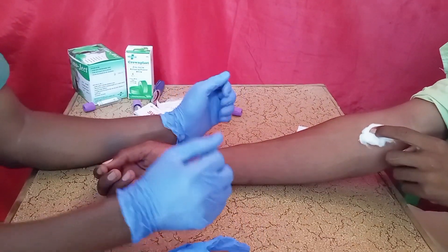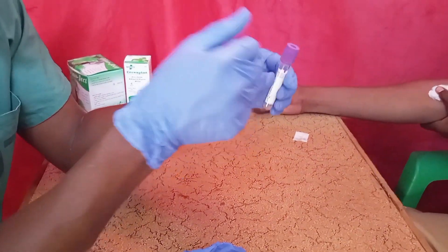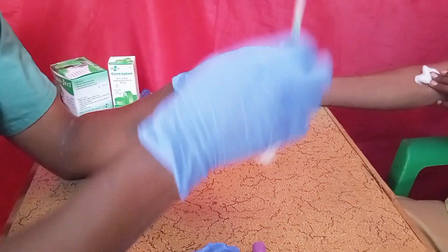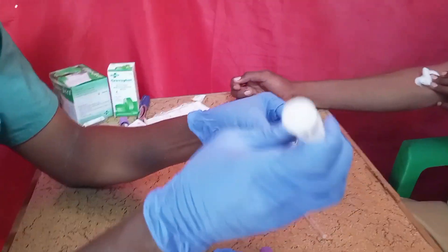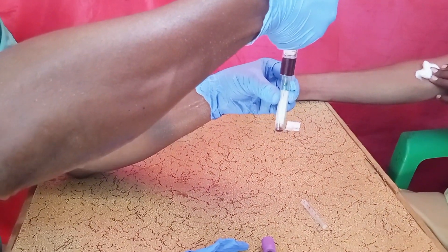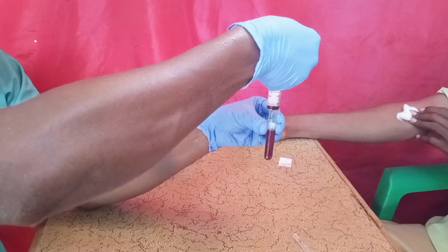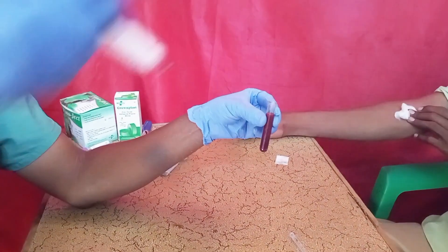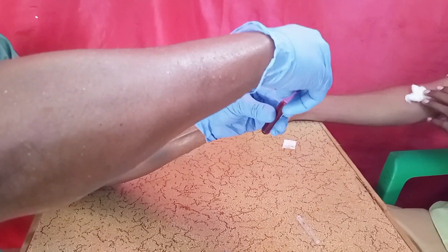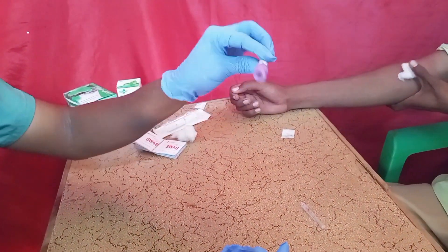Transfer the blood into the blood collection tube. Open the blood collection tube, then transfer the blood into the vacuum container. Close the blood collection tube and shake it gently like this.